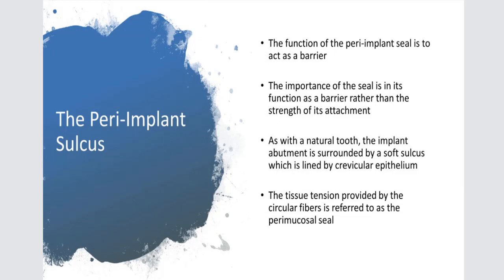It's very difficult when you start periodontal probing around implants. You don't want to get in there and probe really hard so that you're poking through that seal. It's there for a reason, and we want to make sure that when we start talking about that, we're aware of the anatomy, which is why I wanted to start with the anatomy in the first place.